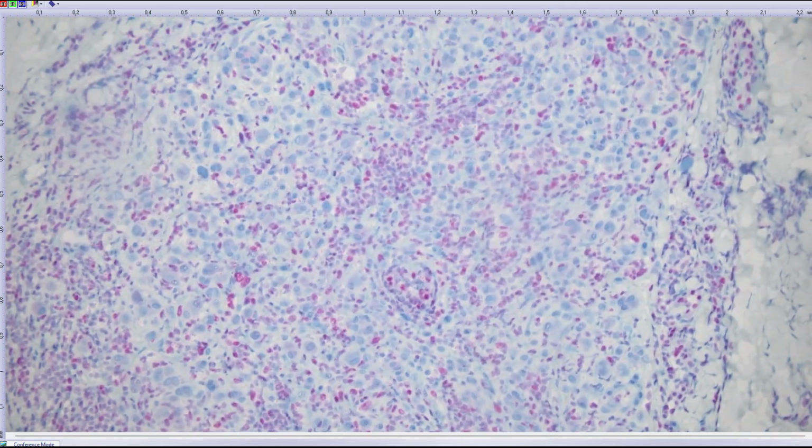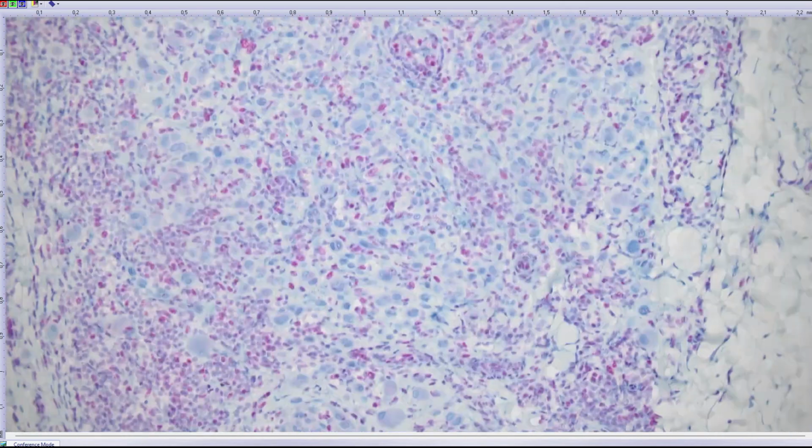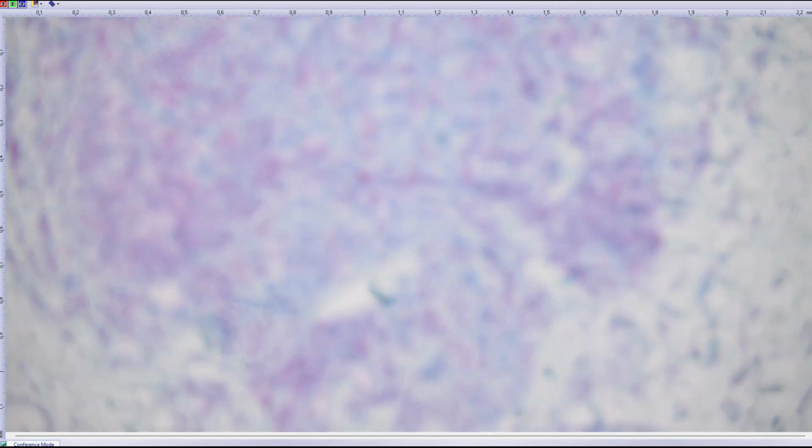Usually it's called BAP1 deficient melanocytoma, and most of these lesions are benign, even if having such atypia. We are aware of very few cases. In our hands, we have only, I guess, 1 case that was a BAP1 deleted melanoma that metastasized to a regional lymph node.